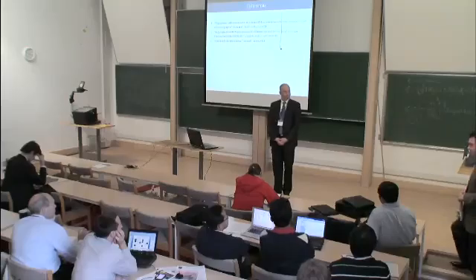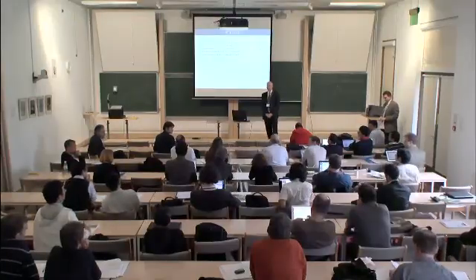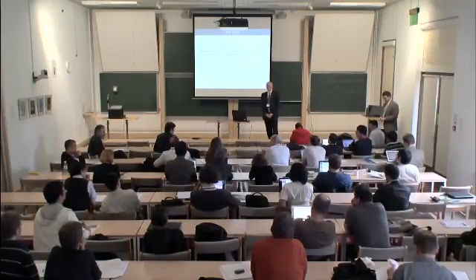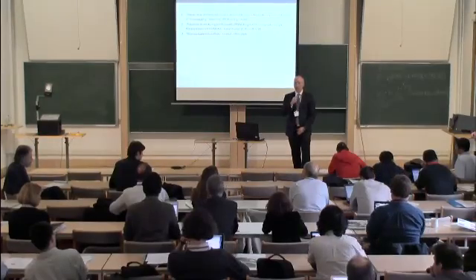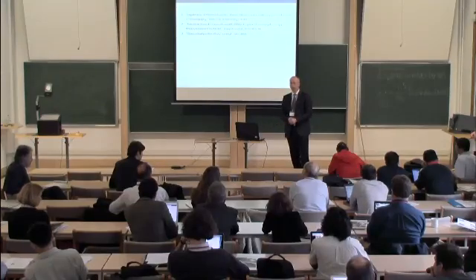Okay, thanks so much. Very quick: when you upload your surface and you have polyps, can you use a couple of polyps as landmarks to co-register? How important is it to be completely automated? It doesn't have to be completely automated. We could ask the radiologist to identify landmarks, as you suggest, and that can perhaps be an initialization to the registration.